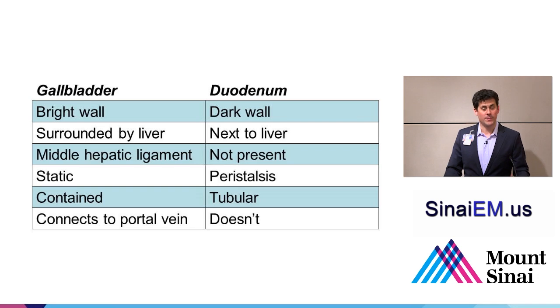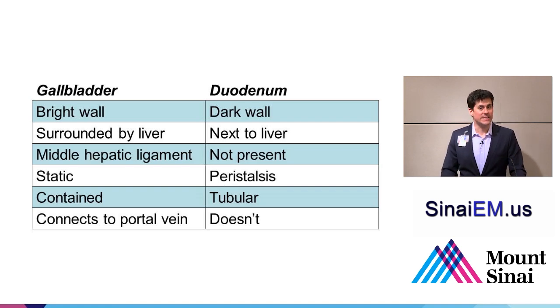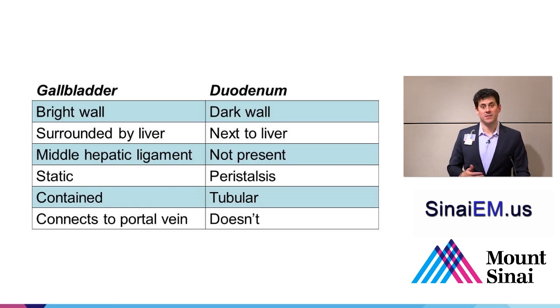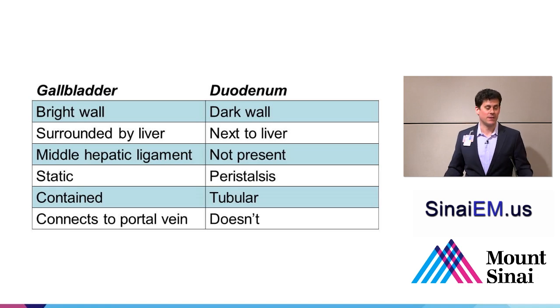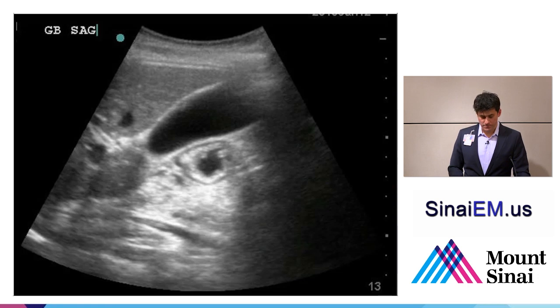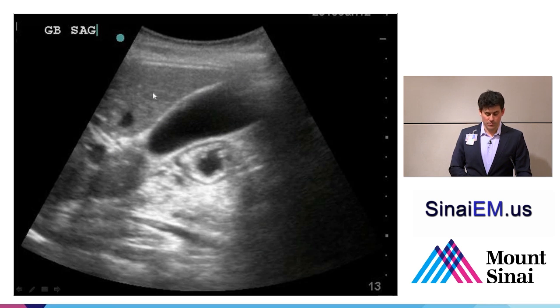The portal vein connects to the gallbladder, and does not connect to the duodenum. The portal vein is relatively easy to find if you fan up and down in a transverse plane at the X-7 spot. Any veins inside the liver with a bright white wall surrounding them are portal vein tributaries — trace them back to the left and right portal vein and then into the main portal vein, which should connect to the gallbladder. Here we see the liver, the gallbladder much more surrounded by liver than the duodenum, with a bright white wall and connection through the middle hepatic ligament down to the portal vein.